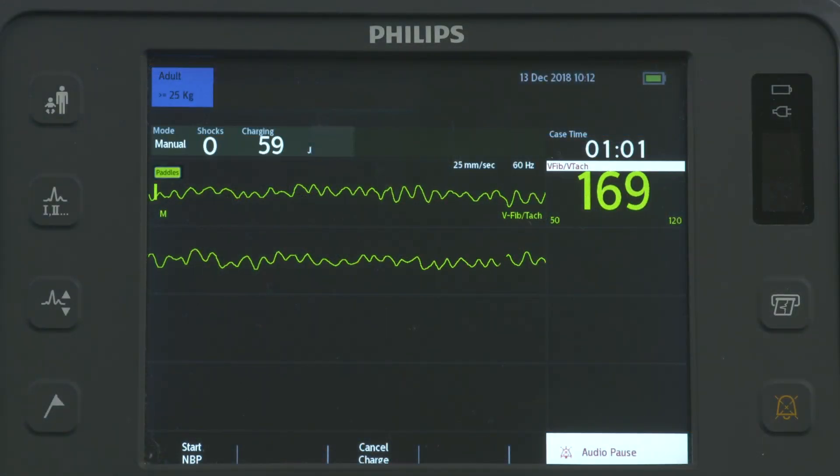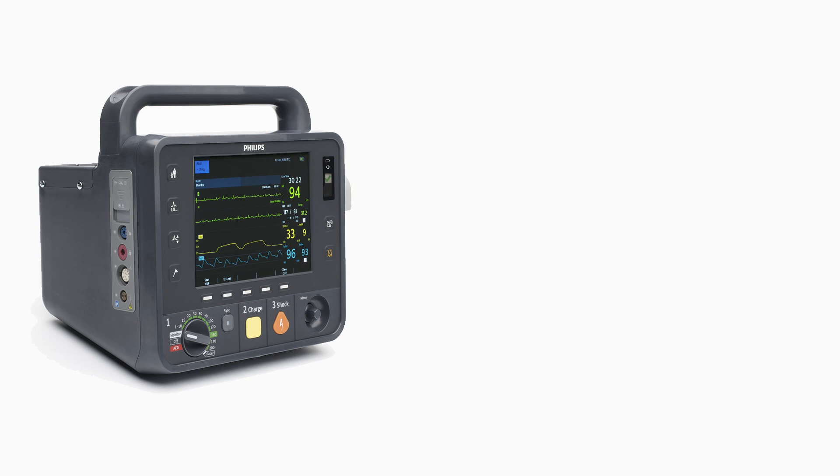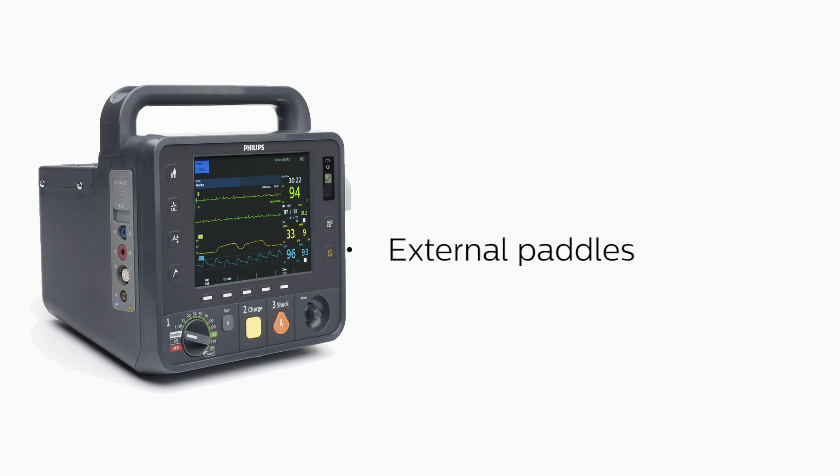With manual defibrillation, you control the defibrillation process. The HeartStart Intrepid lets you perform manual defibrillation using multifunction electrode pads, external paddles, and internal paddles. Here, we'll demonstrate manual defibrillation using external paddles.